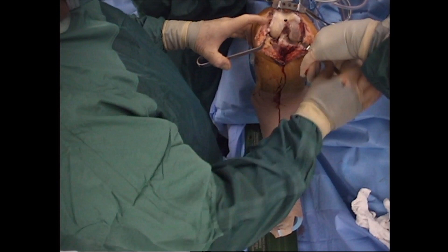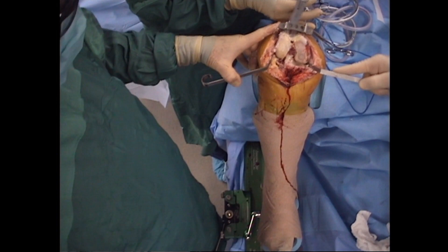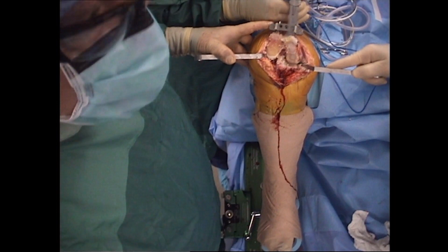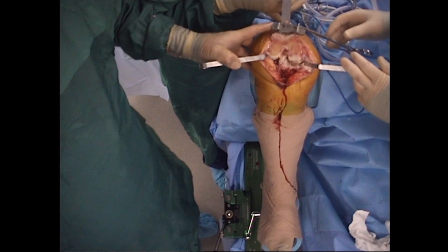A second fresh saw blade is utilized for this femoral cut. The entry on both the medial and lateral condyles are then scored while the blade is the sharpest. The distal femur is then cut full thickness on the medial and lateral aspects. This system is set to take 9 millimeters of distal femur, with 1 millimeter extra accounting for the kerf of the saw blade. The blade is flipped, and the cut is then polished to maximize the fit of the cementless prosthesis.